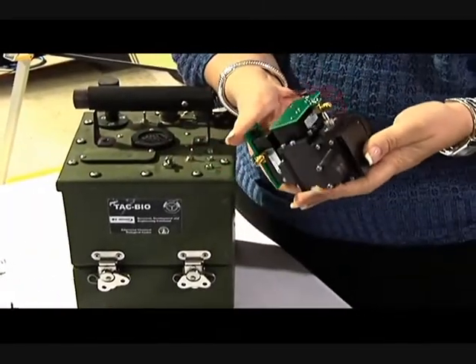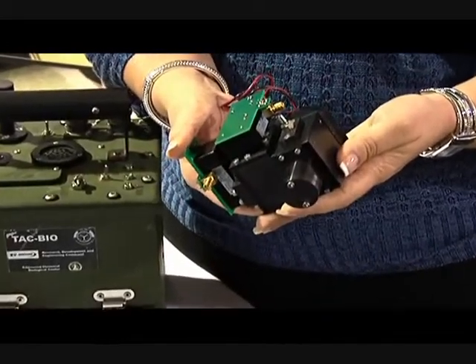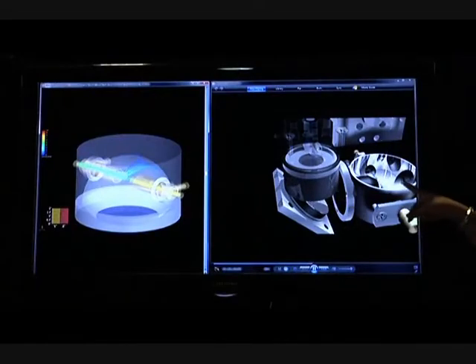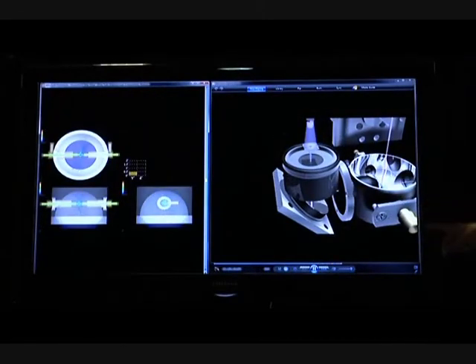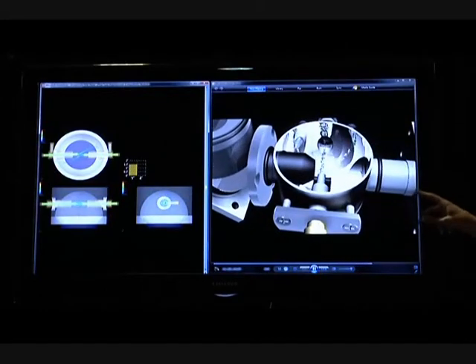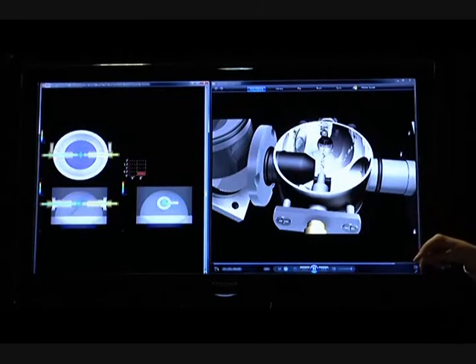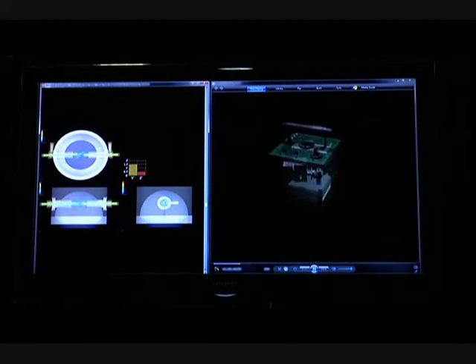The core TAC BioDetector weighs a little more than one pound. The UV LED provides the ultraviolet light, shown in blue. Custom optics focus this light to a point within the TAC Bio's optical body. Aerosolized biological particles are pulled orthogonally through the light source. Fluorescence, shown in red, occurs at the point where the biological agent particle and the ultraviolet beam intersect.